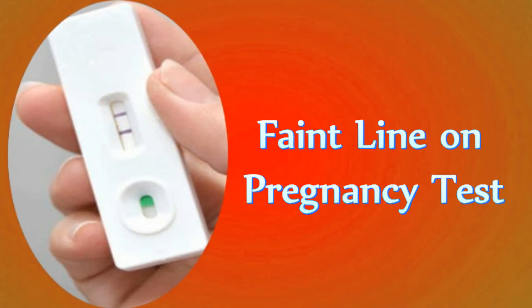You only need to follow all the instructions given on the kit well in order to know your status on pregnancy. There are times when the results obtained are a bit confusing. One such case is the formation of a faint line on a pregnancy test. It leaves you wondering whether you are pregnant or not, whether you have conducted the test properly or not, whether the kit was correct or not, and many more similar questions.